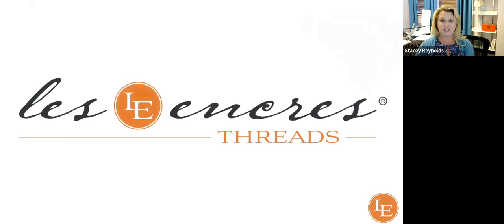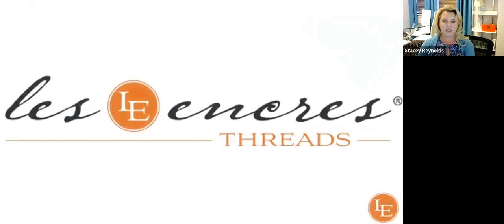We talked about eye threads being used on the lips — there's time to show a video for the lip flip. Setting up with a 26-gauge 50mm blunt lip thread that can help evert the lip, give a little lip flip, fill in volume loss, produce collagen, and help tighten up the entire upper lip area.